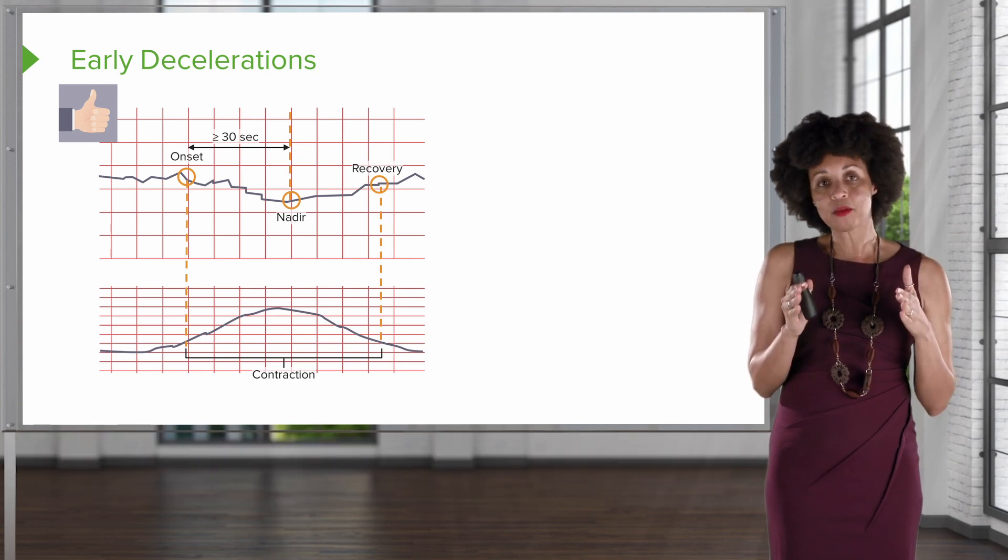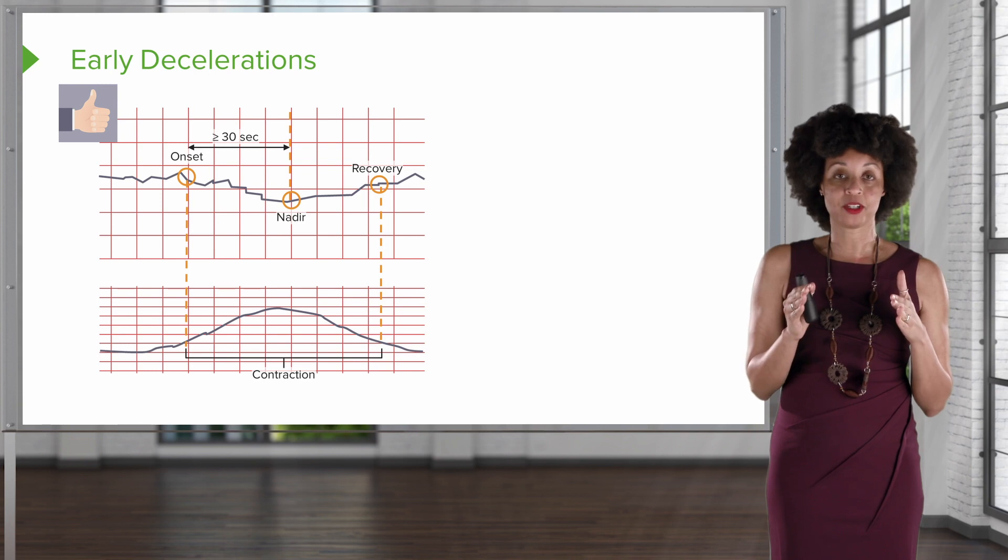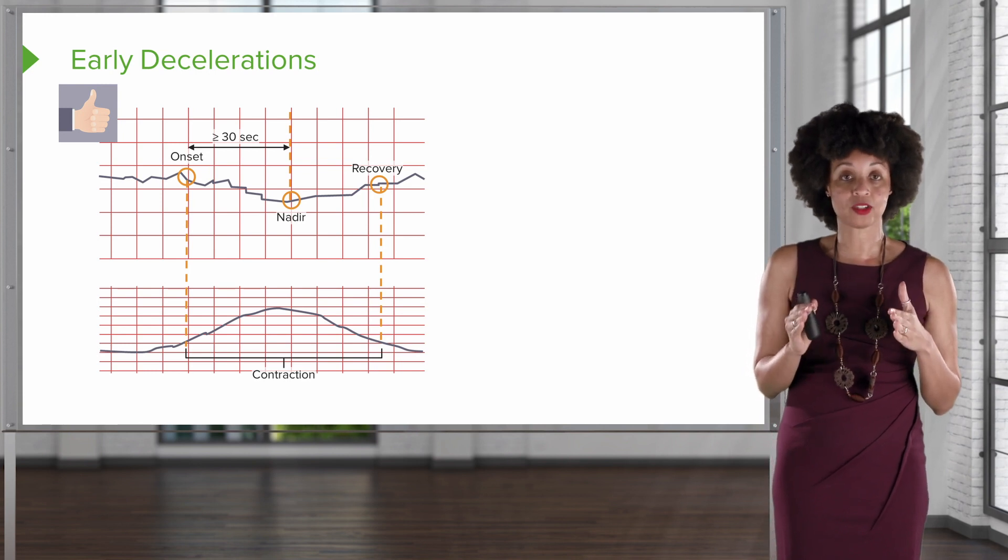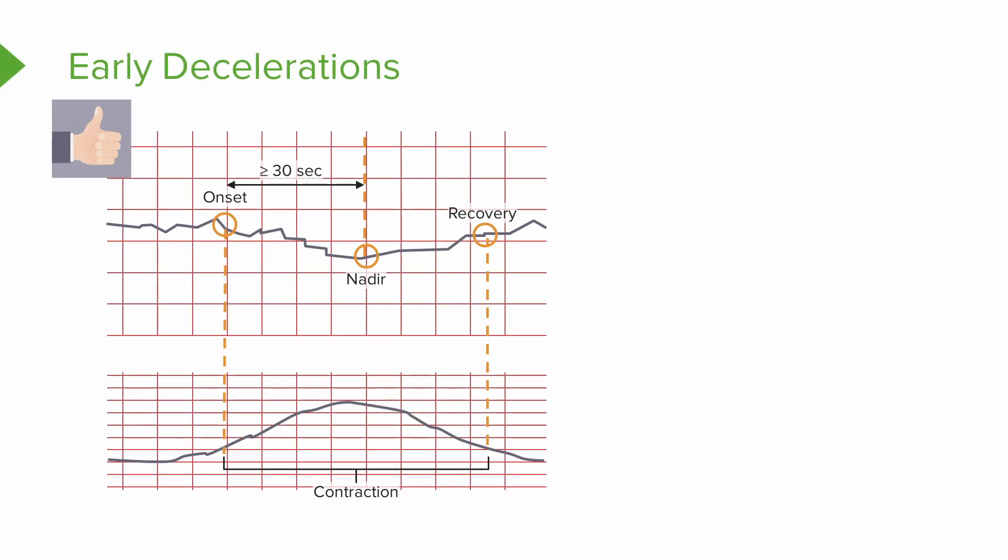We're looking at the fetal monitor, and what we see on the top is the fetal heart rate, and the bottom is the contraction. How would you describe the relationship of the decrease in the fetal heart rate with that contraction? Do you see the onset of both the contraction of the deceleration and the lowest point and the recovery?